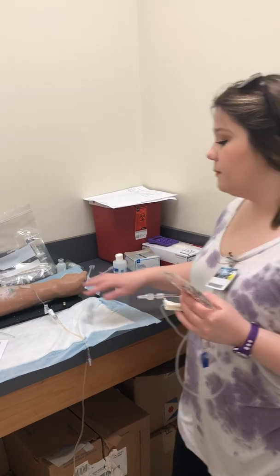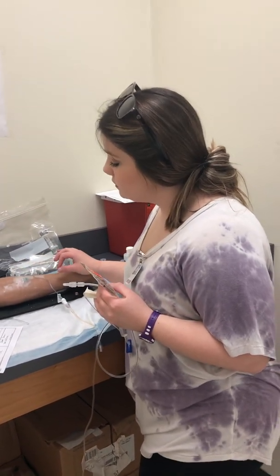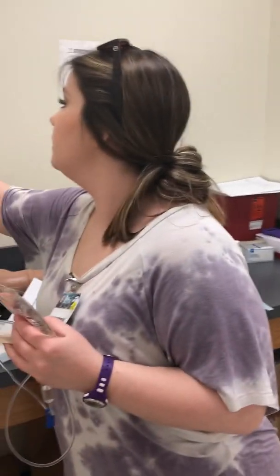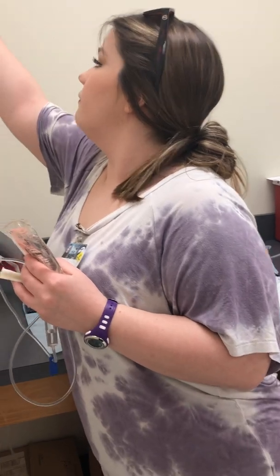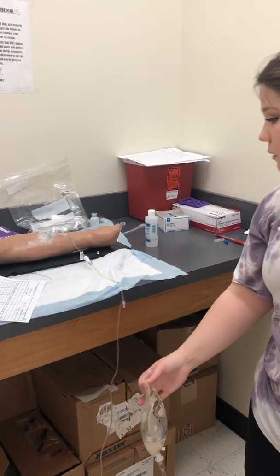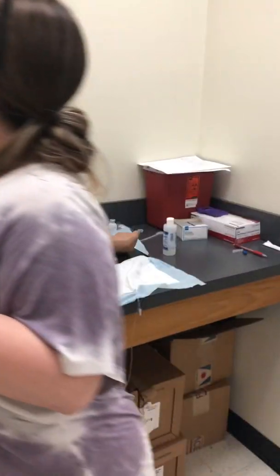Now that I've done that, I'm assessing the site. There's no redness, swelling, or inflammation. Okay, and it's infusing. And I've got D5W, as the MAR says. I'm dropping the bag to see if I get blood return, and I do. Okay.